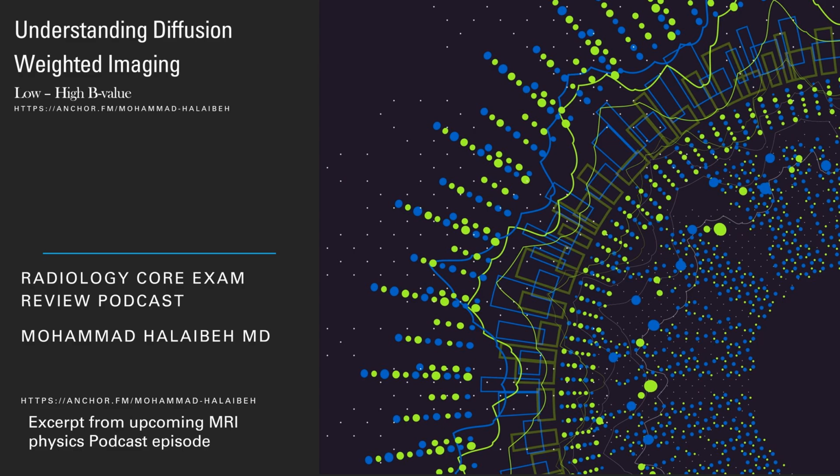As opposed to CSF, the CSF particles or protons in the CSF are flowing through the CSF flow gradient or flow direction through the ventricles, out of the ventricles. And so the signal change is combined into a vector and it would be bright on the ADC map.